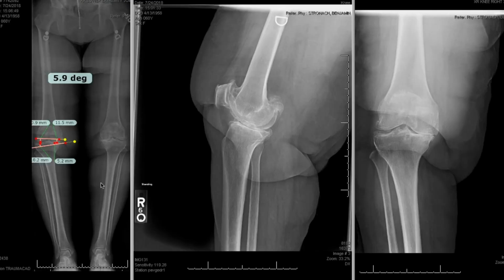I'd like to go over how I utilize the templating in the operating room for information during the surgery. So I like to have my long-standing view up with my resection levels along with the lateral and the AP view. Once I've got all these pulled up, as we start the case, I will do my distal femoral resection first, and this guides me on how to set my intramedullary alignment rod. So in this case, I would have it set to 6 degrees.